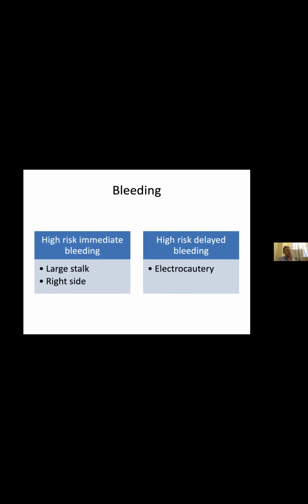I have to say it's not something we see a lot of, but we use very low settings of diathermy, and I'm not very scared of bleeding in front of me. You can almost always, with modern techniques, stop that bleeding, but delayed bleeding, especially if you've got poor access back into hospital, is something that concerns us a lot.